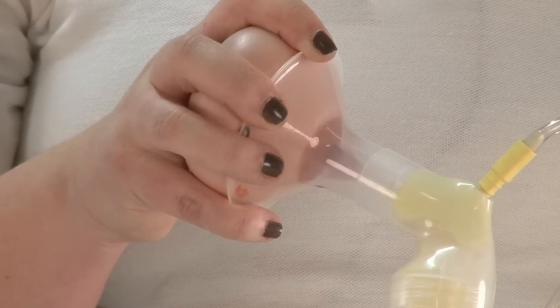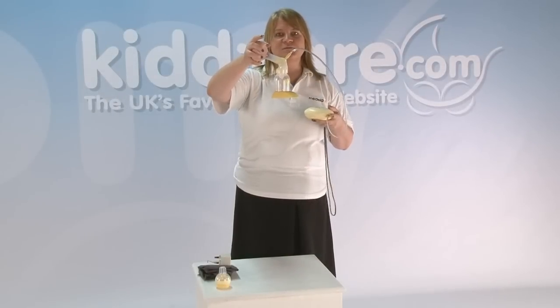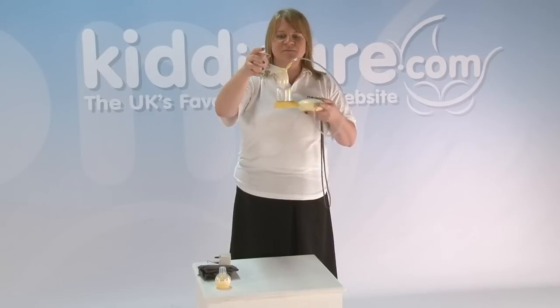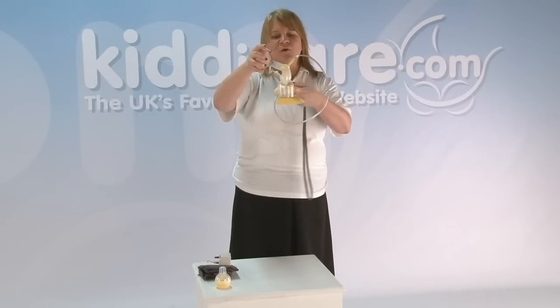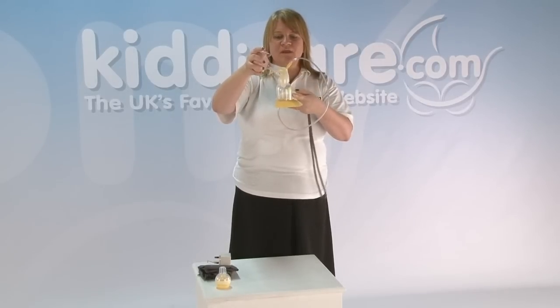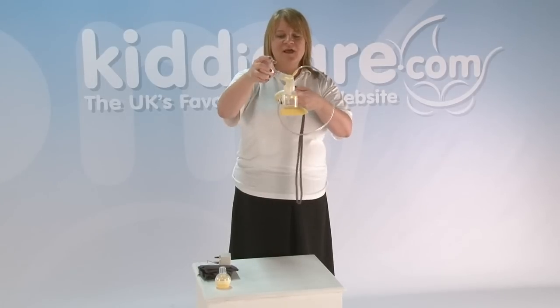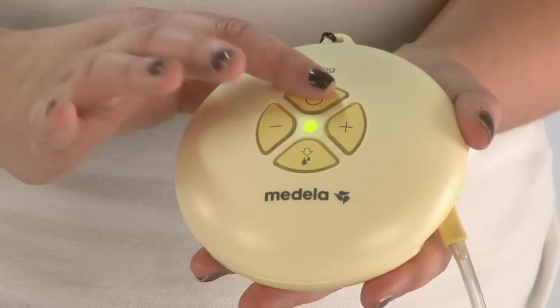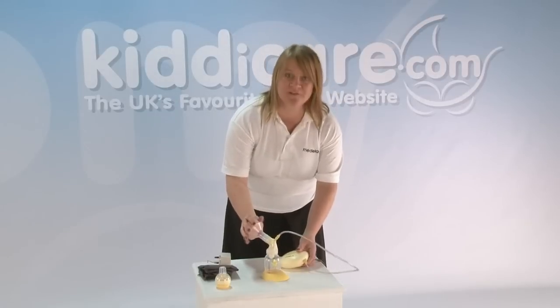That's how the milk will now be transferred from breast into the bottle. What we're looking for when mums express is that the flow slows down after a while and it looks like it's almost stopped, and to mum, the breast feels soft. At that point, give it another minute or so and then turn it off with the on and off button at the top. So that's the two-phase expression.